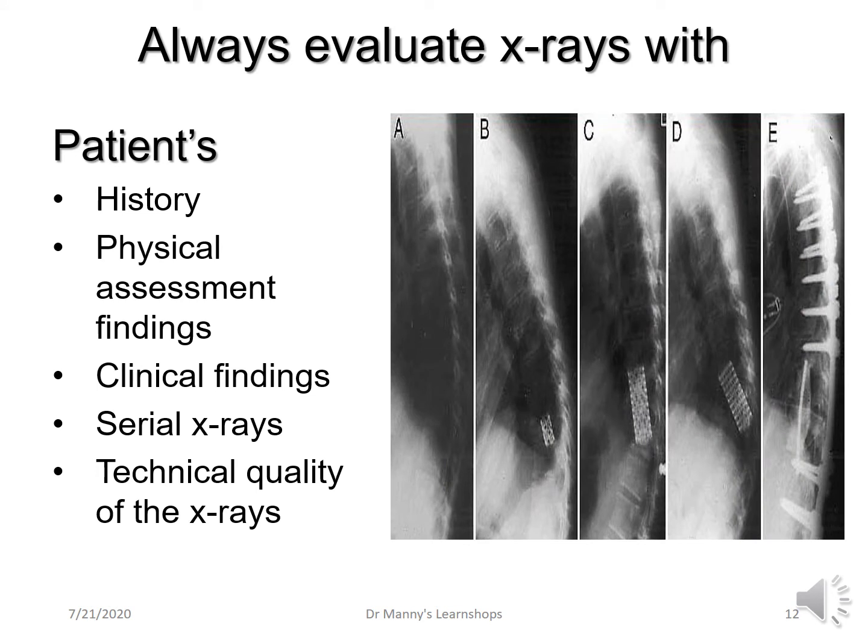Always look at serial X-rays, chest X-rays, because the X-ray may have been taken 10 years ago, and you can compare it to what it is now 10 years later. And as a consequence of that, it may give you information.